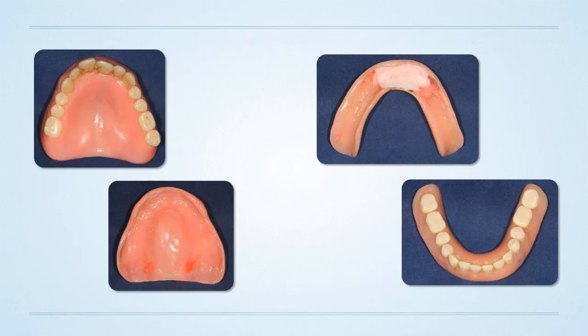But as a courtesy, I'd also like to go ahead and offer, at no cost to you, I can clean your upper and bottom teeth before you go. Oh, sure, doc, here we go. You can clean this up for me. And no joke, I did not make up this picture. The patient hands me his denture, and he's got this wadded up almost tissue on the lower part of his anterior ridge of his lower denture. And he's got the stuff in his upper denture.